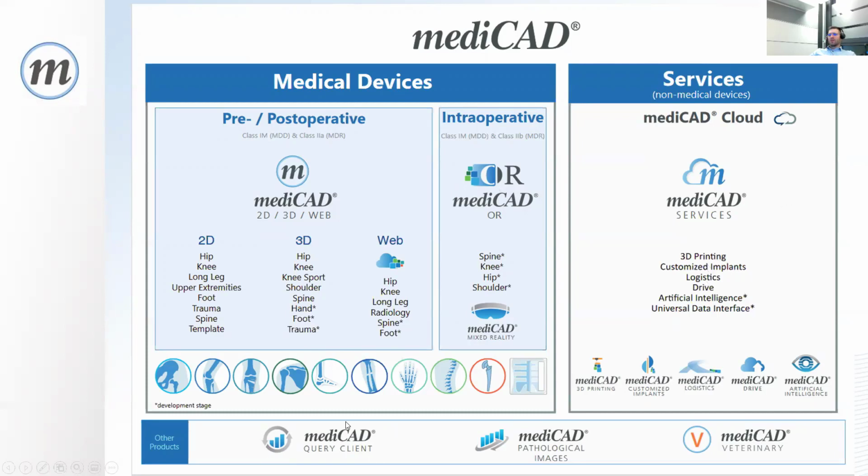Another special thing, which I will tell you about a bit later, is the query client. This is a link between a PACS system and our modules. So this is a very short overview. Again, when you're interested in that, give me a short note or a hint, or just visit our website. Everything is explained there in great detail.